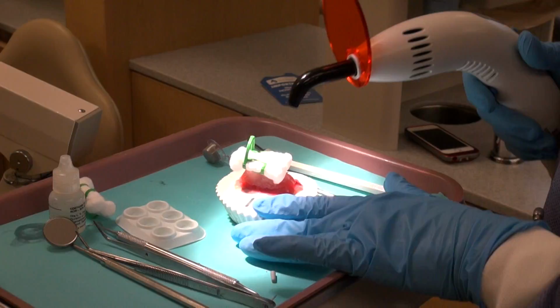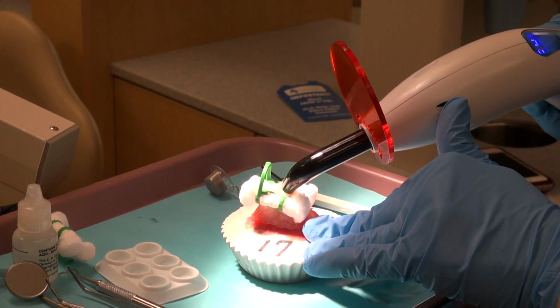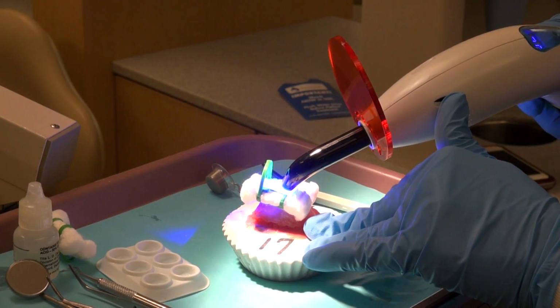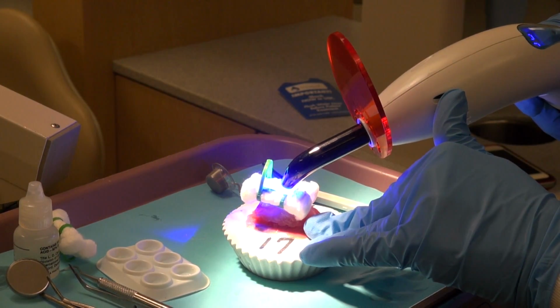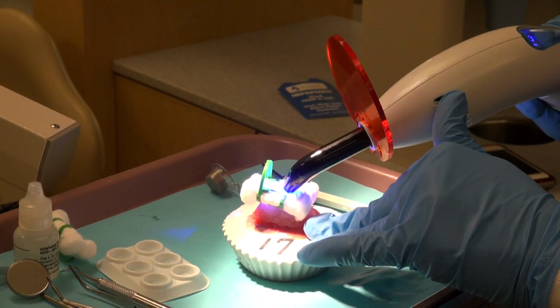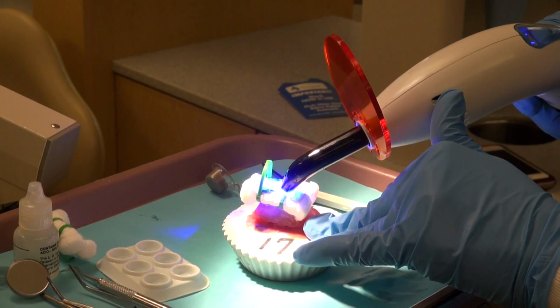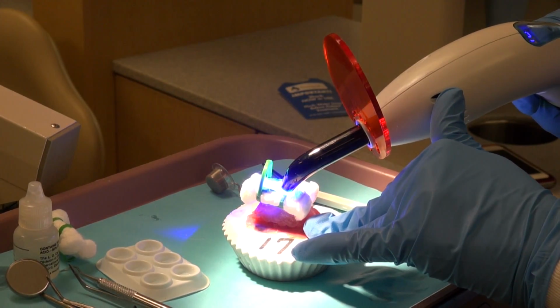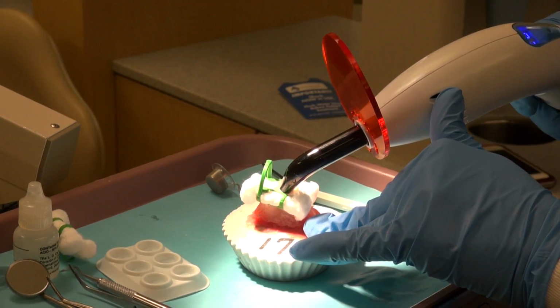Okay, the next step is curing the material. We're going to place our tip about 1 millimeter from the occlusal surface and cure this for 20 seconds. And when it's done, this will beep. That was 10. It counts down for you in the little LCD window. And we're almost at 20. There we go.